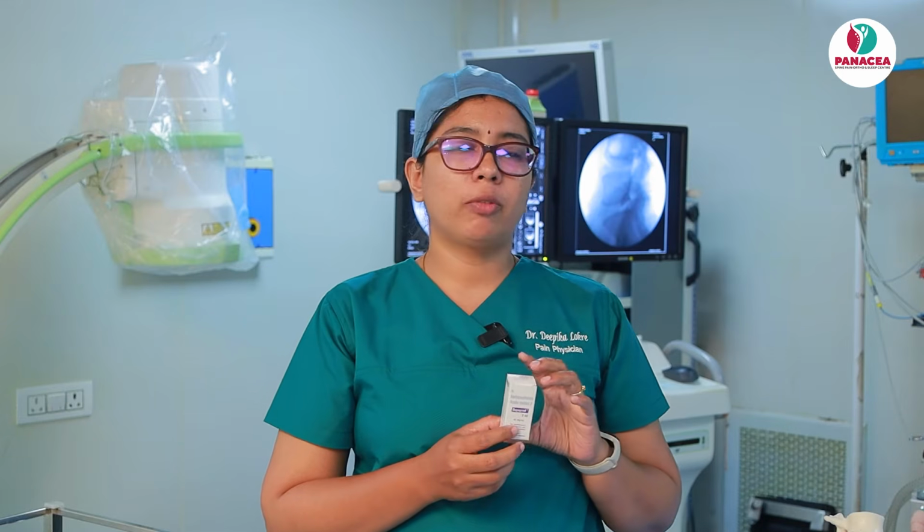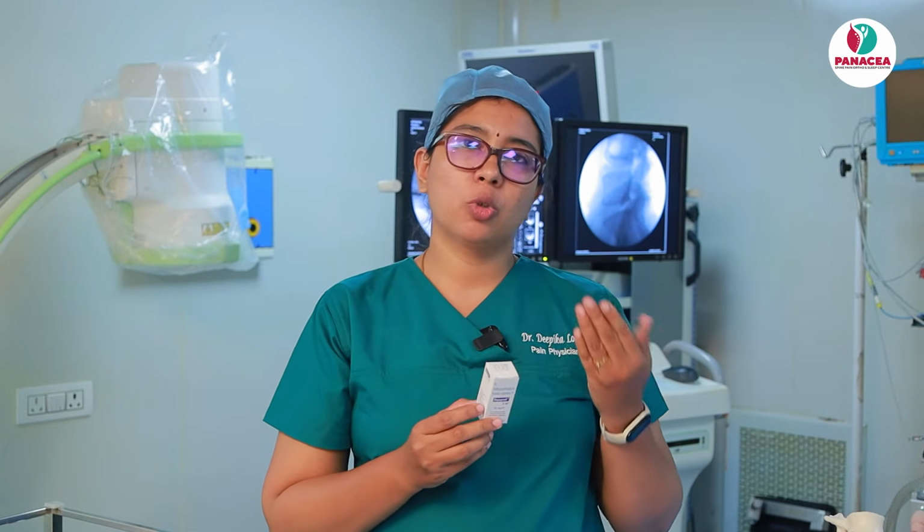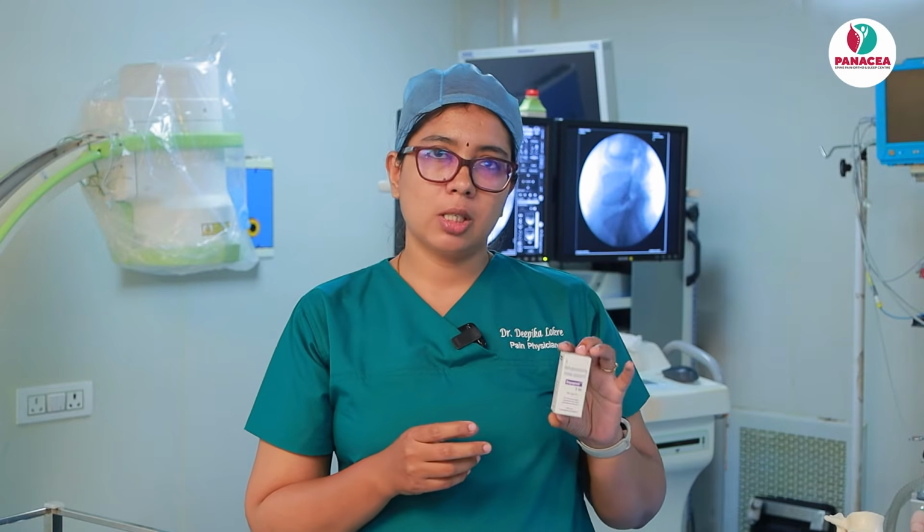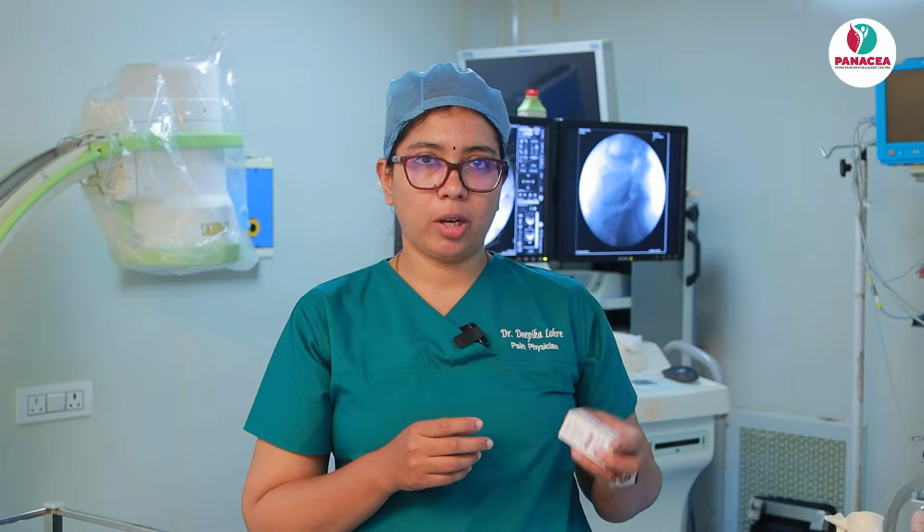Okay, and even just 20 mg is more than enough. You don't have to give 40 mg, 80 mg, more than that. It does not make any difference. You can give usually 20 to 40 mg, which is more than enough to give in the spinal transforaminal.